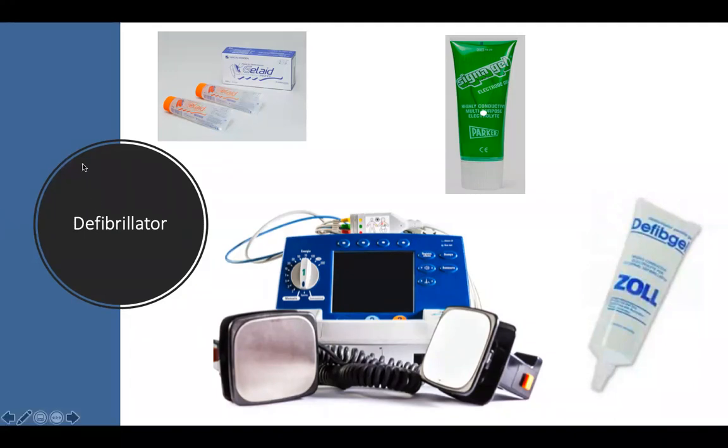So it's unacceptable to not check the defibrillator. And if your theater does not have a defibrillator, you need to talk to your theater matron to make sure that you have a defibrillator, because according to the theater standards, your theater is lacking and it's not safe.